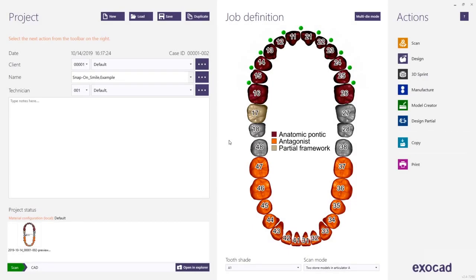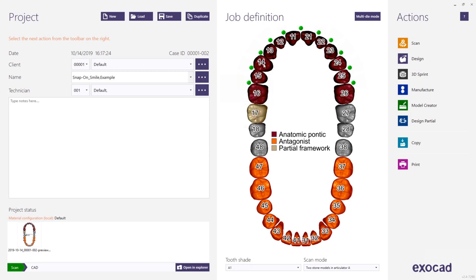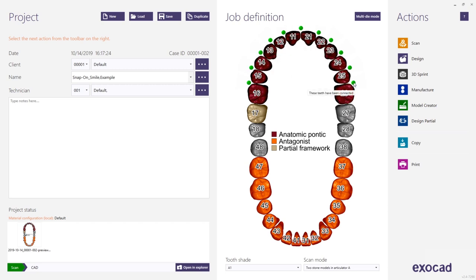In this video I'm showing you a simple workaround to create a snap-on smile using the partial framework module. For this I'm selecting the work type Anatomic Pontic for all but one of the teeth where I want to create a snap-on smile. I also activate the connectors for all of them.